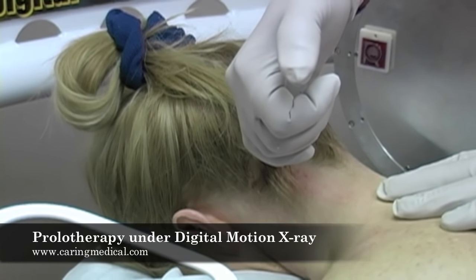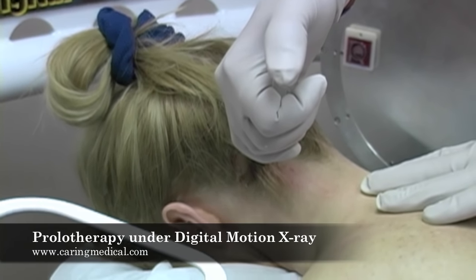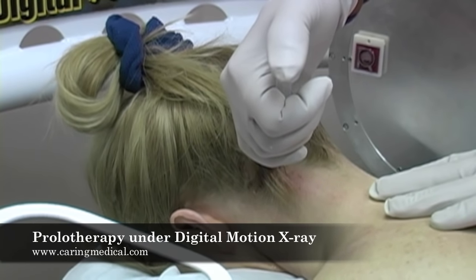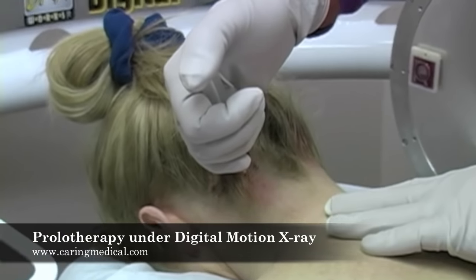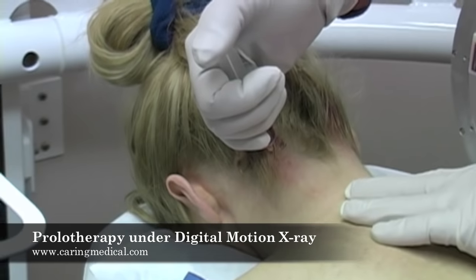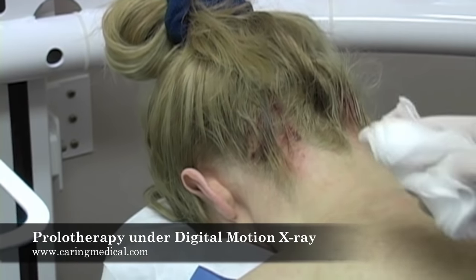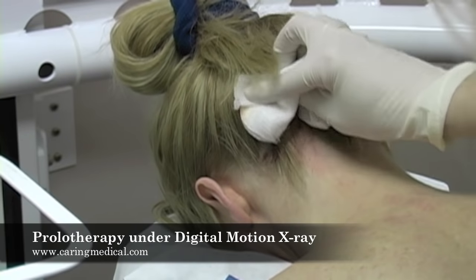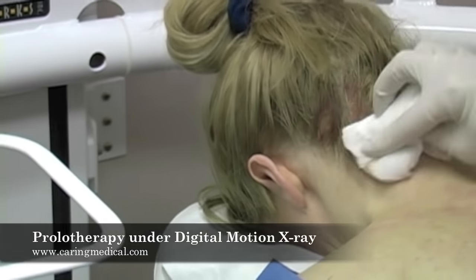In this particular patient you can see there's a red solution — we're actually using stem cells. I'm doing a type of stem cell prolotherapy onto the C1-C2 area under fluoroscopy. This particular patient has done extremely well and is making a good and quick recovery.